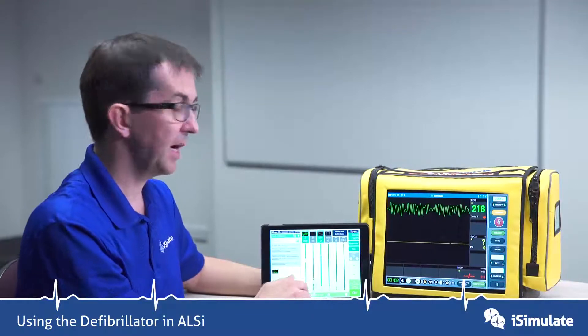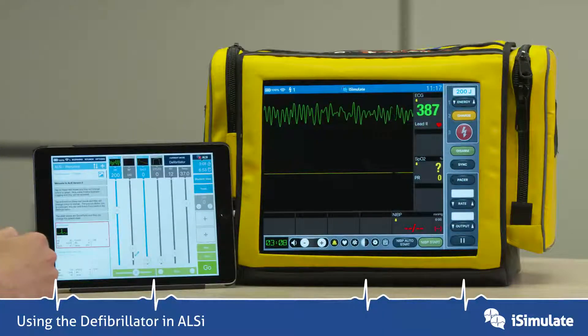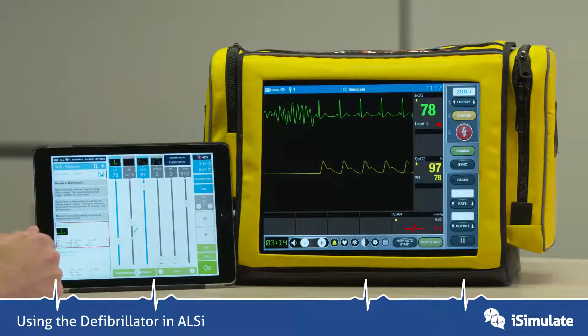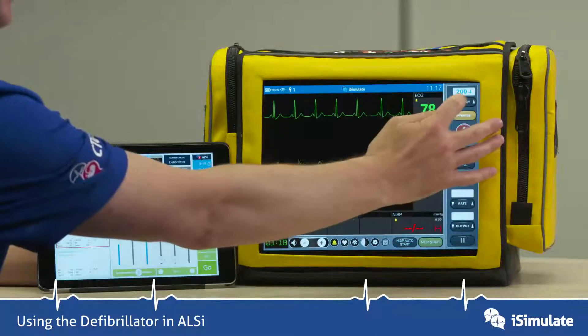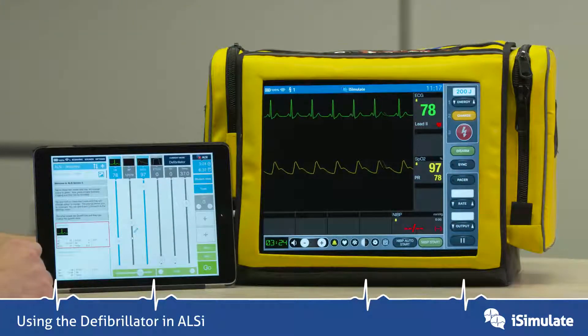Now let's show how you can disarm. We're going to charge again. Now we're going to put it into a sinus rhythm, so we don't want to shock this. You can either disarm it by pressing the energy buttons, or you can press the disarm button, and that will disarm the defib.